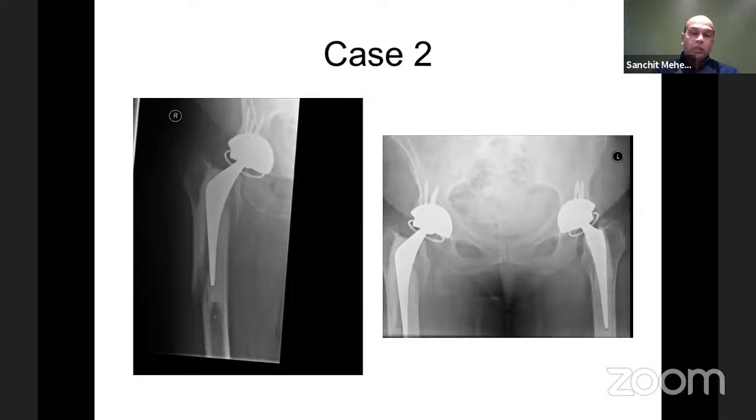normally the approach to these fractures is fairly difficult because obviously the femur is broken, so you cannot rotate it. Plus the fact that it's got a constrained mechanism in place, you have to get access to the constrained mechanism. Okay. If we apply the same things that we talked about, this is a C-stem of the older design, and again, goes with the taper slip thing. This is a B2 periprosthetic fracture.